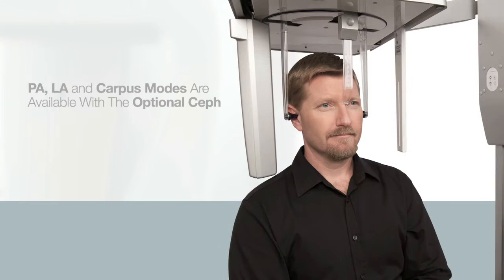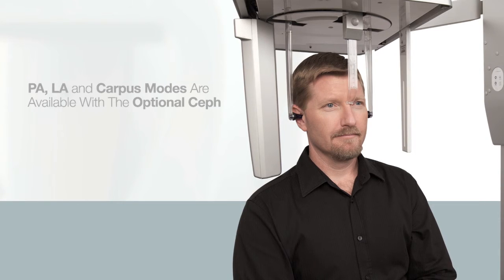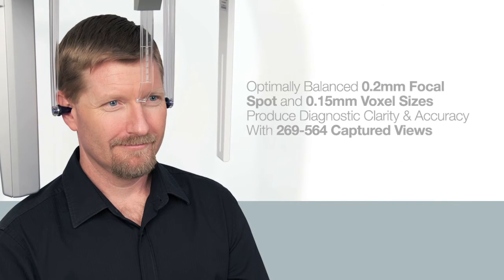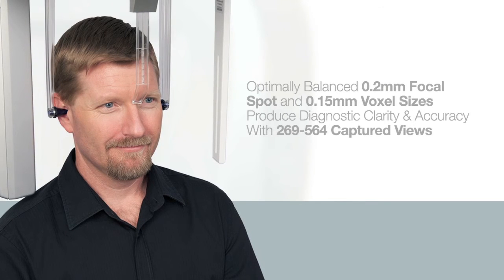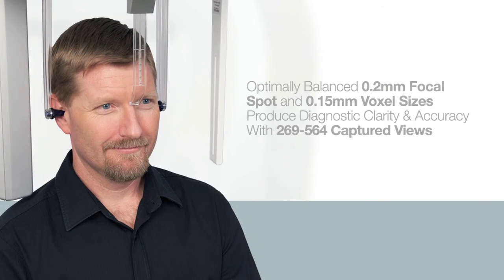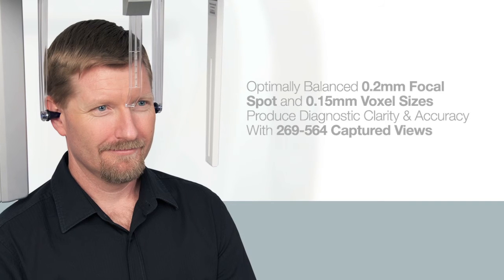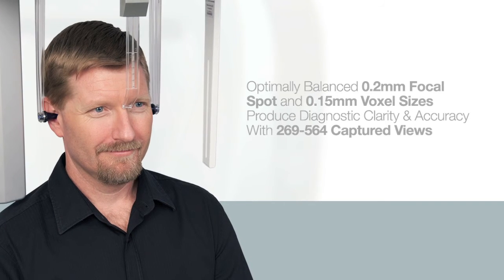Posterior Anterior, Lateral Anterior, and Carpus Modes are available with the optional Ceph. Optimally balanced 0.2 mm focal spot and 0.15 mm voxel sizes produce diagnostic clarity and accuracy with 269 to 564 captured views.